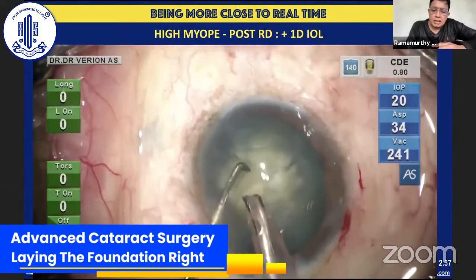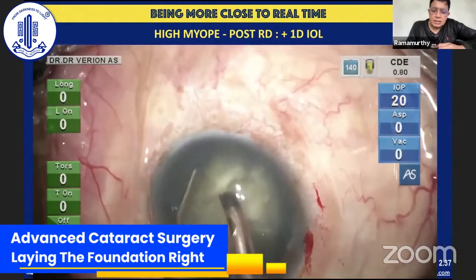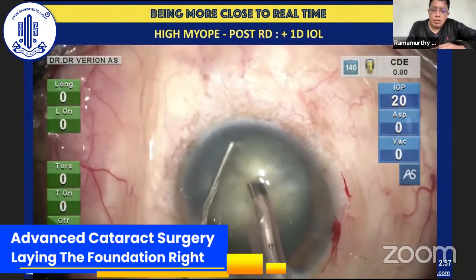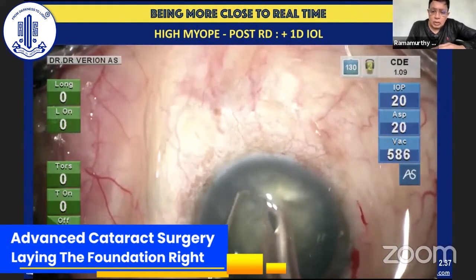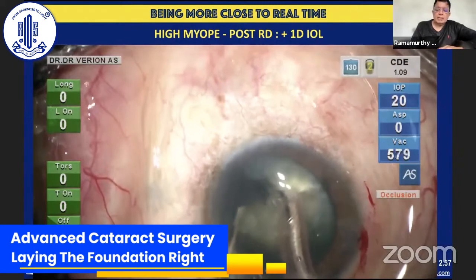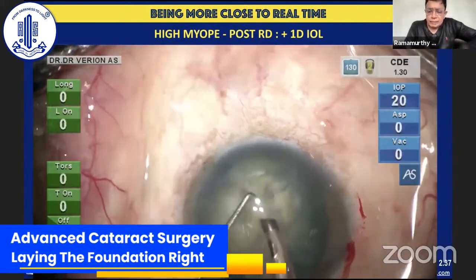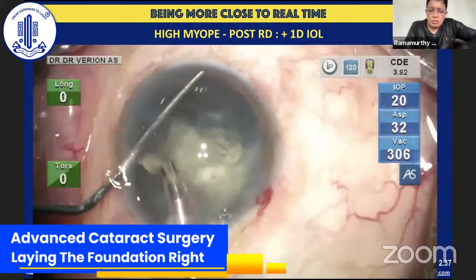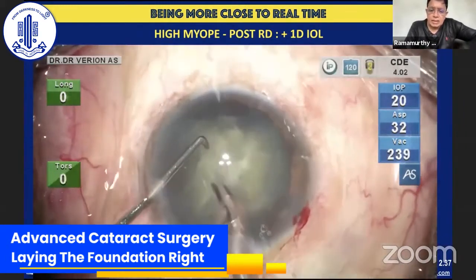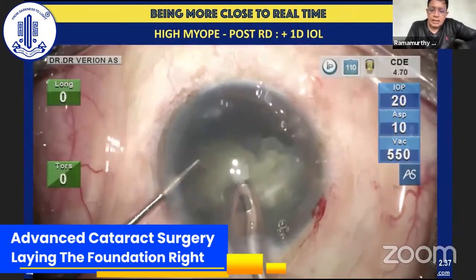As you can see, in spite of the fact that it's a highly myopic eye, an eye which has undergone retinal detachment surgery, the orientation of my phaco probe is fairly horizontal. This is because of the low intraocular pressure that has been kept. And I'm able to enjoy a vacuum of about 600, aspiration about 34. The Active Sentry technology, which is activated whenever it's needed, also enhances the safety as well as the stability of the anterior chamber.